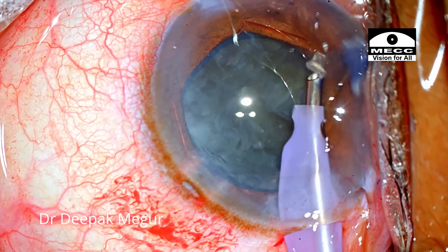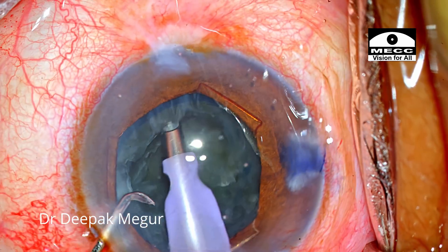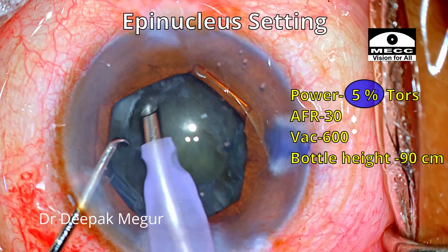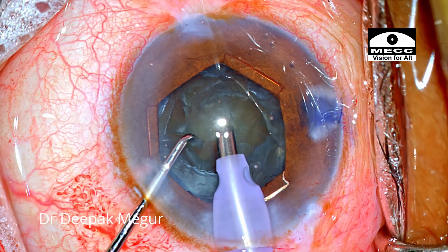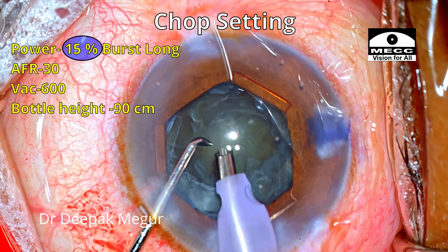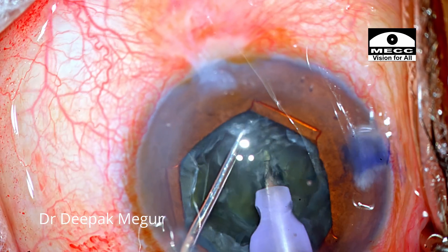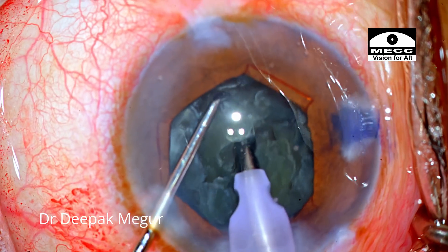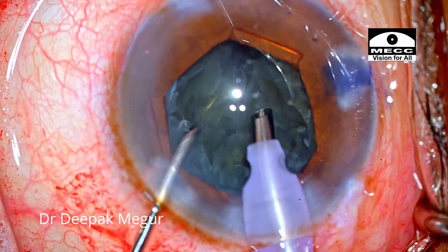I'm expecting a very soft nucleus, so I need to be careful about phaco parameters. Initially I enter in epinucleus mode to clear overlying epinucleus and cortex using just 5% torsional energy. For burying the nucleus I set power to 15% longitudinal burst. The tip is buried and lifted — it's a very soft nucleus. I get a partial chop; the posterior plate is still intact, only the superficial part separated. Even 15% energy was too much. After a second chop some fragment separation has occurred.